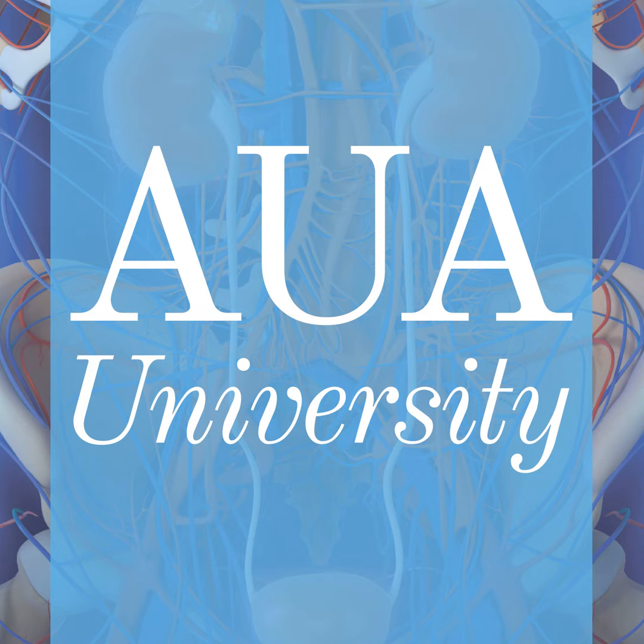So for local recurrence, as we discussed, you would use the 18F-1007 tracer because it's not excreted renally. If you would expect systemic disease, bone disease, you might use the gallium tracer, and you might repeat your PSMA PET scan if it's negative with this F18 1007 tracer.